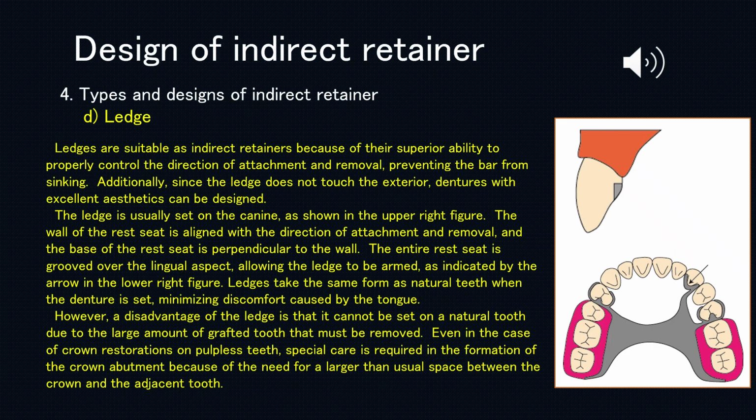Additionally, since the ledge does not touch the exterior, dentures with excellent aesthetics can be designed. The ledge is usually set on the canine, as shown in the upper right figure.